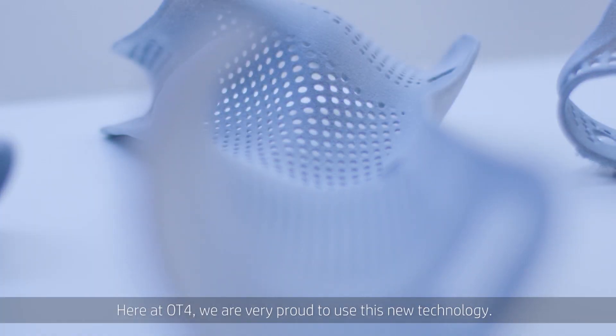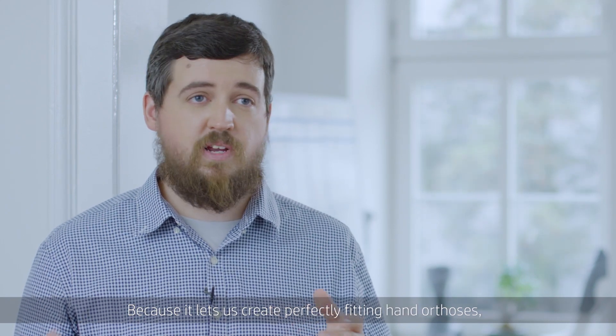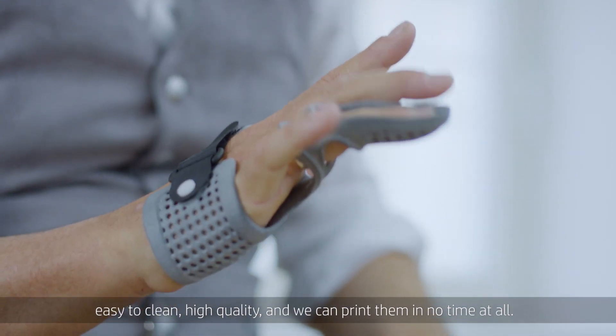Here at OT4, we are very proud to use this new technology because it lets us create perfectly fitting hand orthoses, easy to clean, high quality, and we can print them in no time at all.